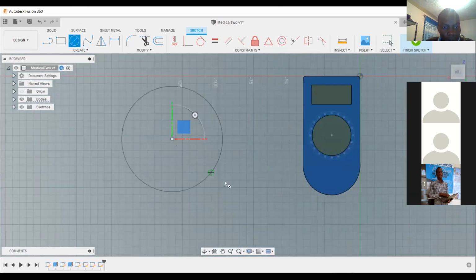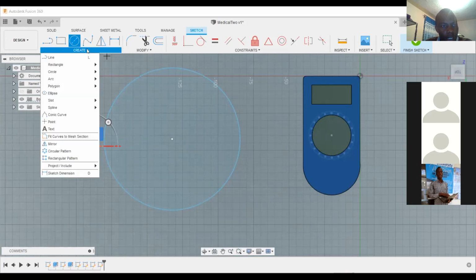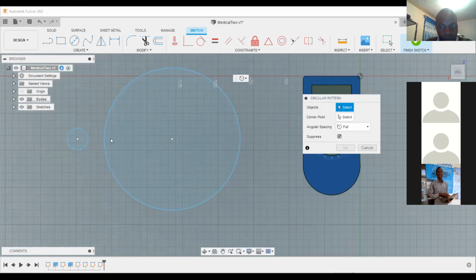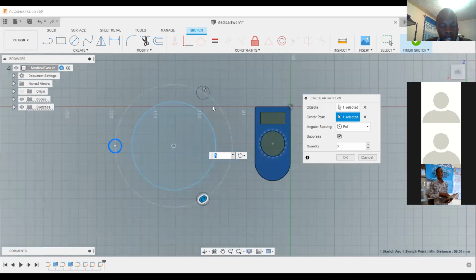So let's say you are having a circle here. I'm just showing you on the side so that you see. If you're having a circle here, then you have another circle outside here. So you want to create a pattern of this second one around this first one. So you can come to create circular pattern. Then you click on this, and then you select center point. You click the center of the first one. Then it will draw a circle around the first one.